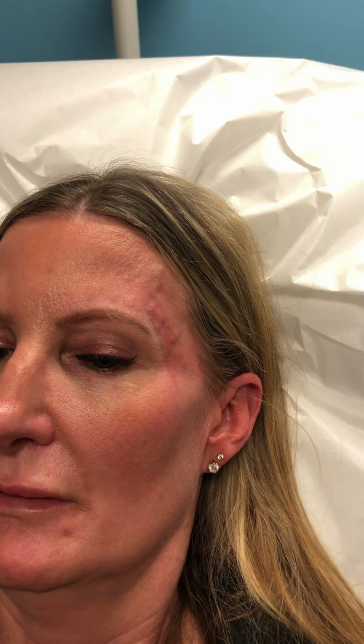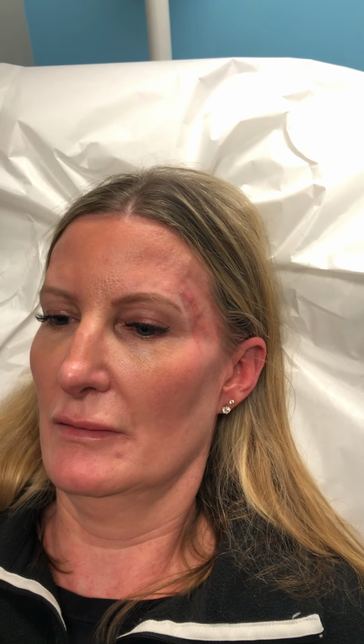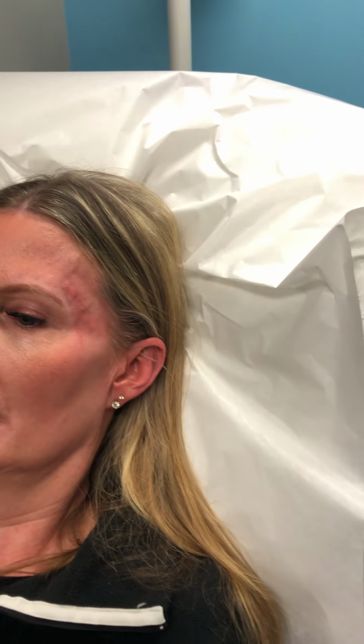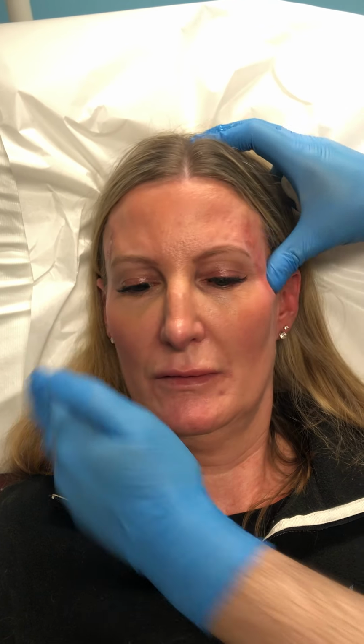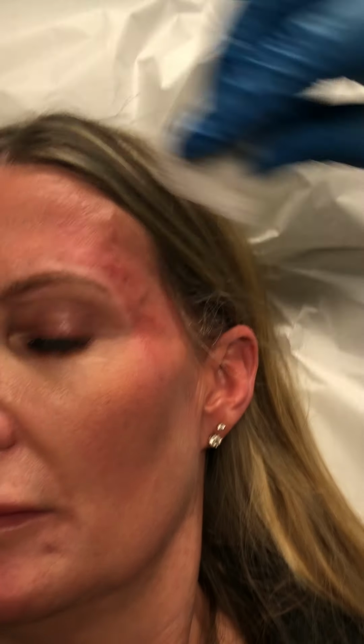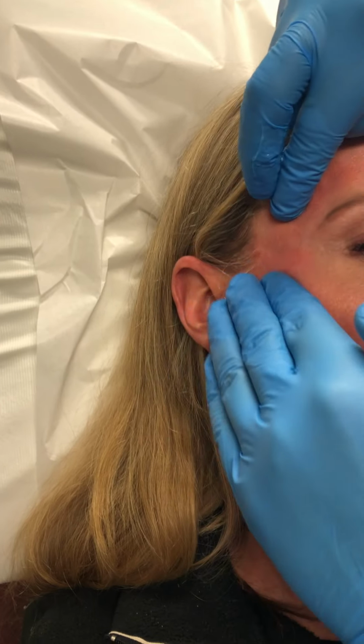Okay. And then we'll just take a little alcohol. I need a little gel too, just to massage a little bit of your temples. So you can see it's not really hard, or you don't see any lumps or bumps in here. It's all just flattened, but it's definitely softened the contour here. And turn a little bit to the other side. Not bad, huh? We did both temples in a matter of 5 minutes.